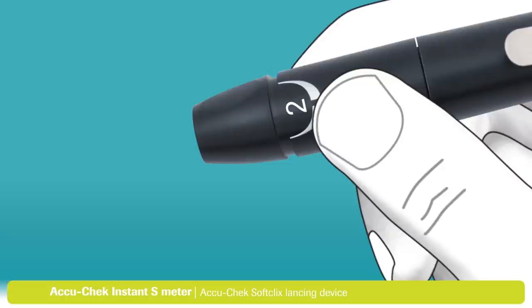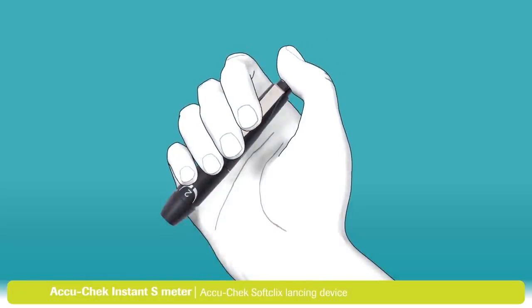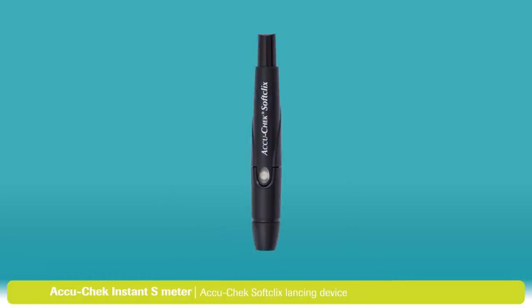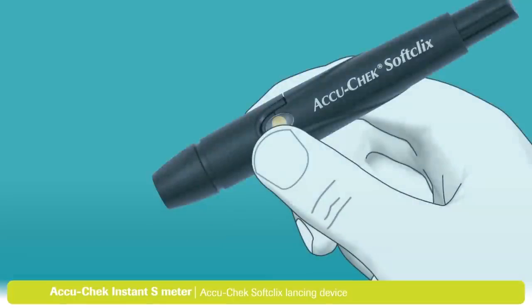To use the lancing device, you first need to prime it. Press the priming button all the way down. The release button on the side of the lancing device has now turned yellow. This indicates that your lancing device is now primed and ready to use. Press the yellow button to release the lancet. This will lance your finger.